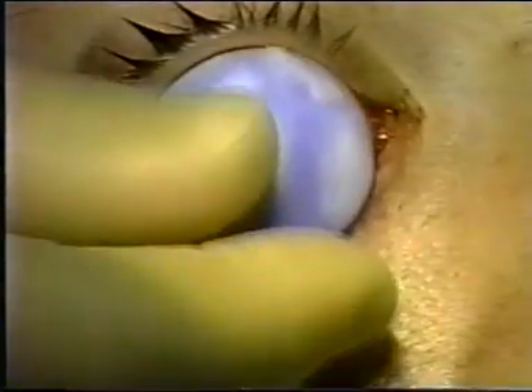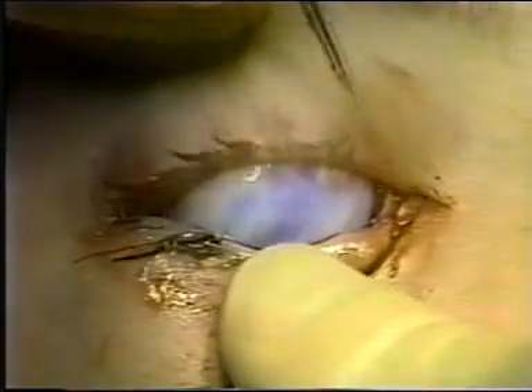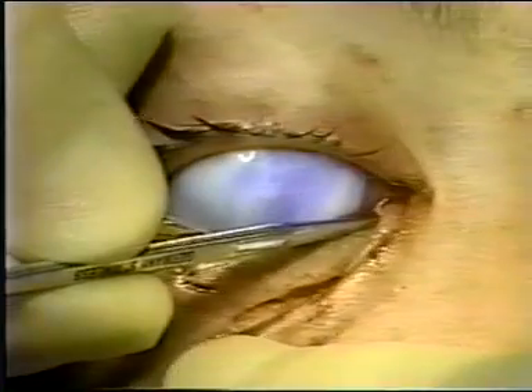A scleral shell is essential, allowing the patient to be more comfortable and prevent damage to the cornea during the surgery. The punctum is dilated using a regular punctal dilator.